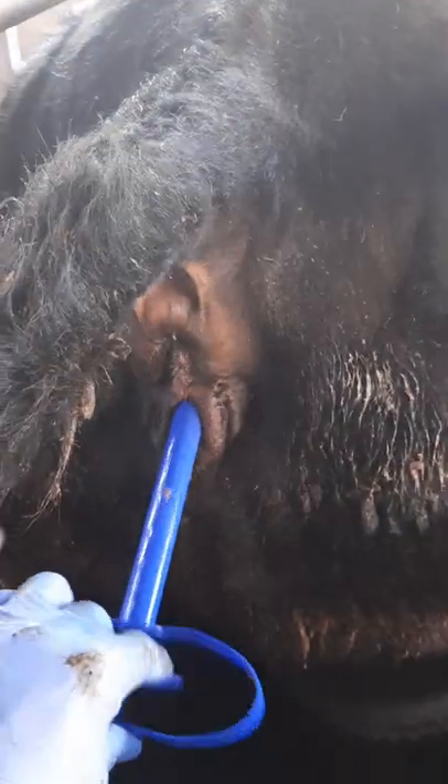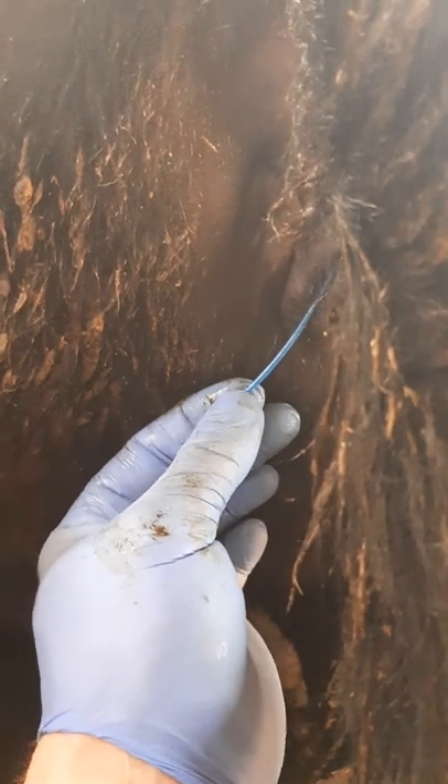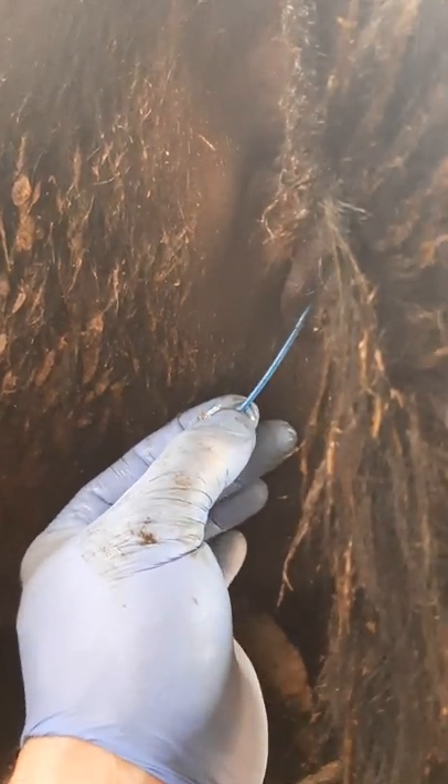Release your applicator, keep it compressed, draw her out. When it's settled you should see the tail, which is there. Now I've cut these tails to save all the heifers pulling them out, but I just leave them long enough so that you can see them. You will be checking a couple of times a day to make sure they're in. Any that are lost — if you find them in time, give them a rinse and put them back in. You won't affect your program.